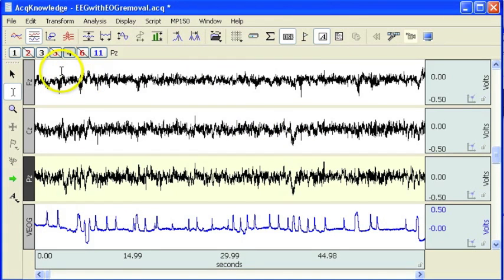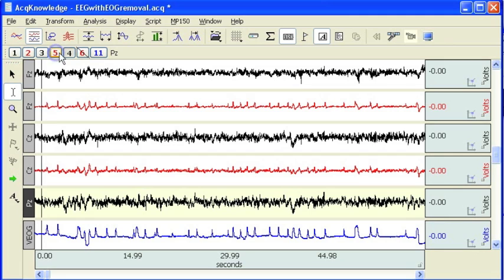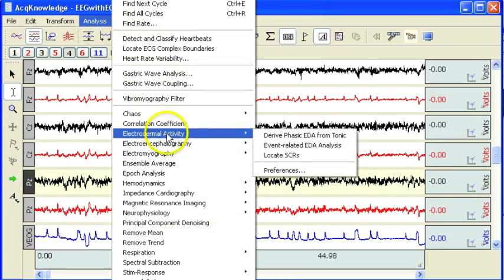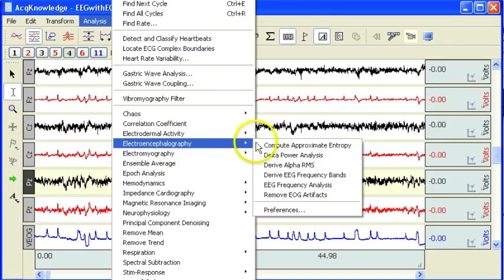If I go back in and turn our duplicated channels back on, this is FZ, we can clearly see that the EOG removal has been able to eliminate a lot of these blinks. Same with CZ, although that wasn't contaminated quite as much, and then PZ also. So that gives you a quick demonstration of Acknowledge's automated EOG artifact removal tool.